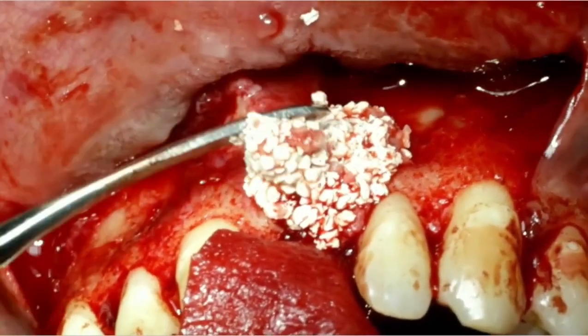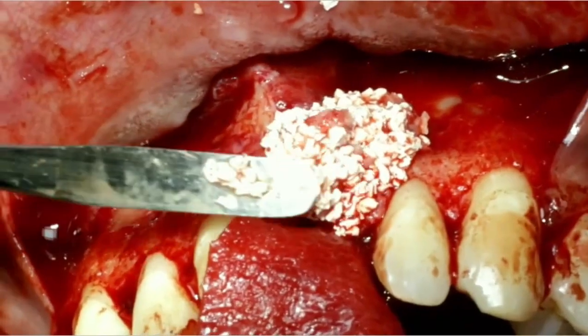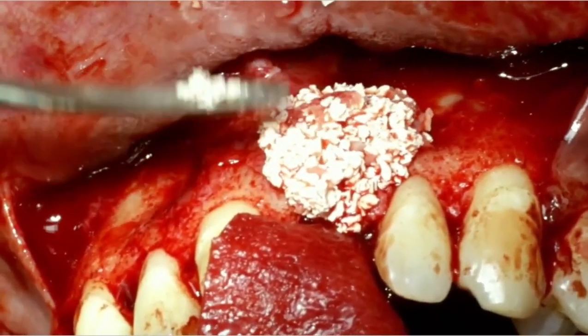We make overcorrection to compensate for the amount of the future bone resorption.